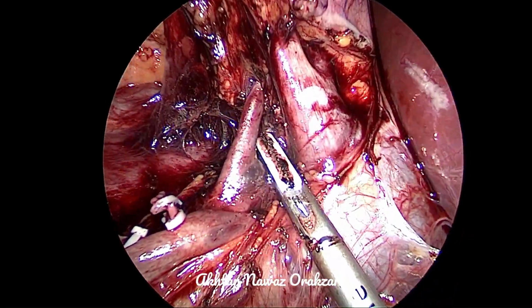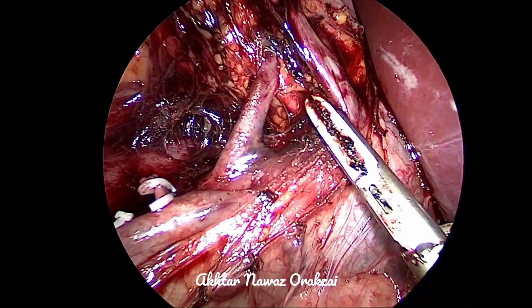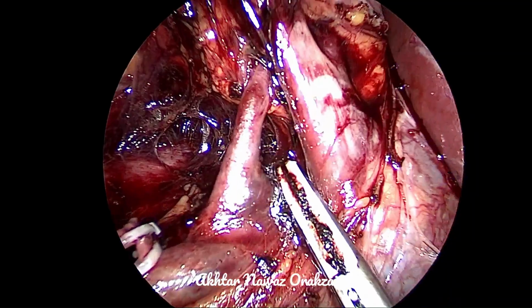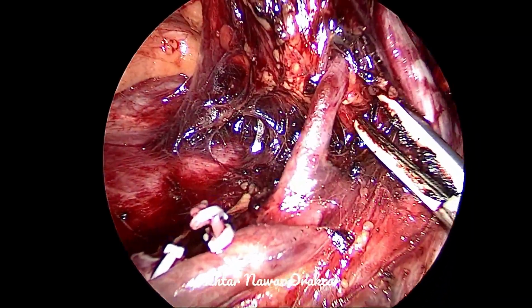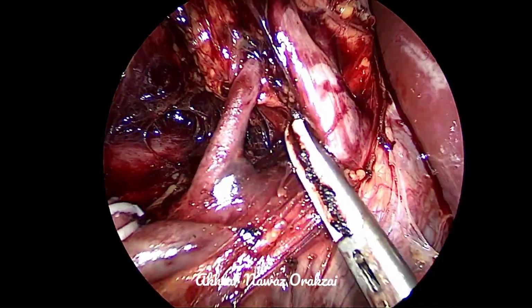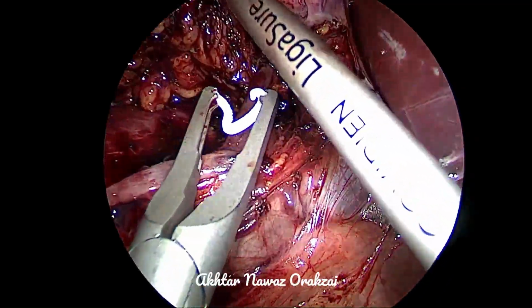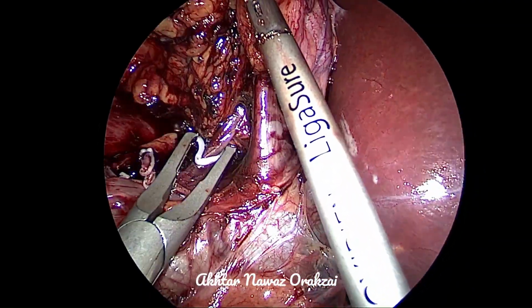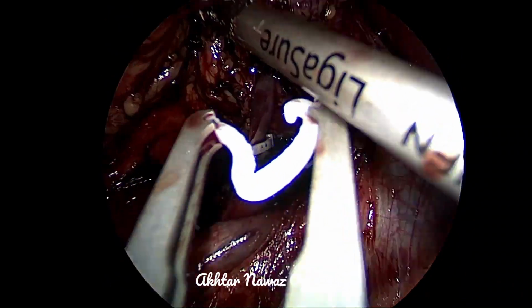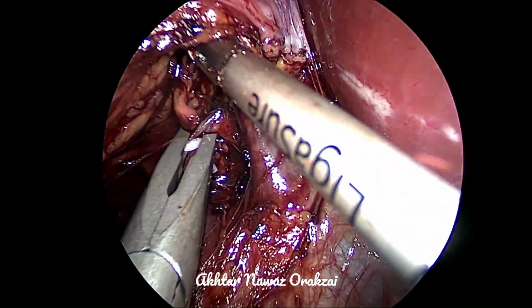As a general rule, the lymphatics around the artery are abundant, and once you are able to dissect more and more of the lymphatics around the artery, the length of the artery that you achieve is good enough, and you can then apply Hem-o-lok clips. So here we have applied a Hem-o-lok clip. We have decided to clip and divide this vein.